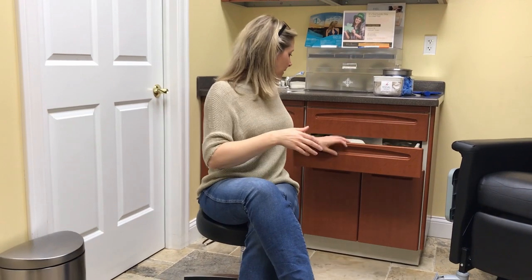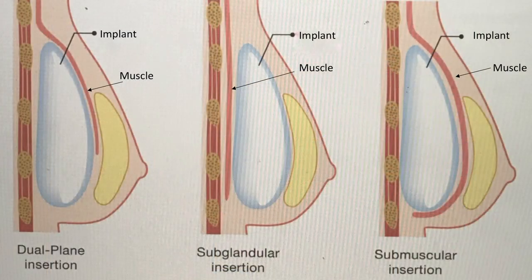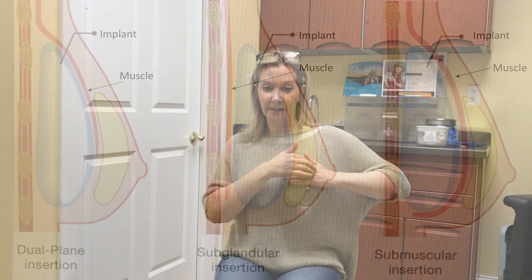The reasons why, there's pros and cons to both positions. Under the muscle has the added benefit of leaving an extra layer of tissue to cover the edge of that implant. So it's really a dual plane. When you put the implant in, you lift the pec muscle and reflect it up above the muscle. So your implant is covered in the upper half or upper three-quarters down to the level of your nipple, but then the lower portion of the implant is actually covered by breast. So it's in two planes. And that leaves an extra layer of tissue, your muscle being here underneath the skin layer, to hide the edge of that implant and disguise any kind of rippling or wrinkling. So that's a nice reason to put it under the muscle in people who have no breast tissue at all. If you lifted their breasts and put that implant above the muscle, it'd be a thin layer to cover this. So that's one group that I almost always put in at that dual plane position.